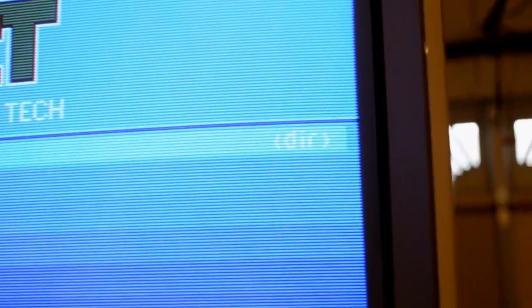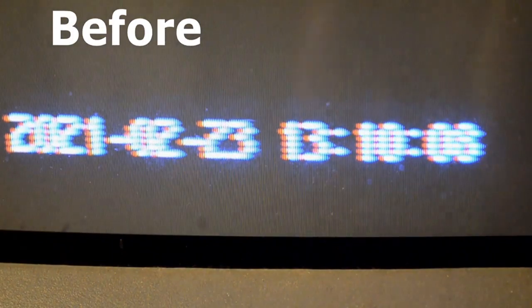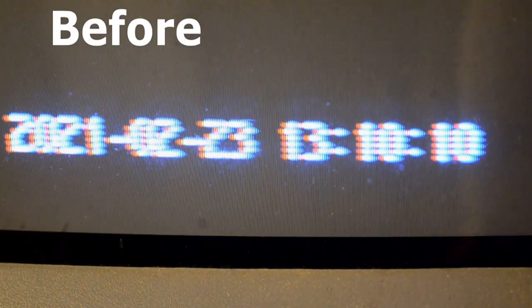So again, this is that big long side that you saw earlier in the video, and it's against the right-hand side of the monitor when you look at the screen. And that was an offset, and then we had the convergence issues. But this is after recap and calibrations. That screen is pushed all the way up to the side there, and we have no black line. And we also got a way tighter convergence down here on our bottom portion and corners of our screen.